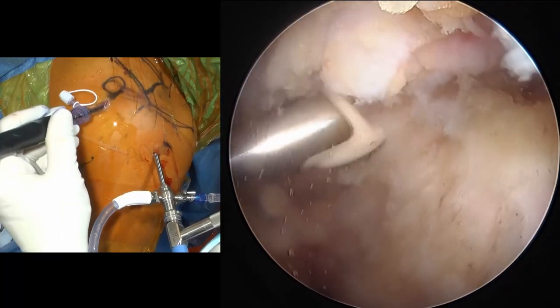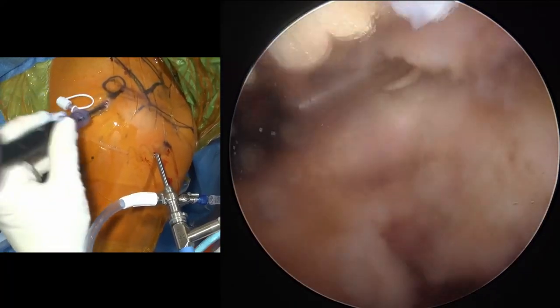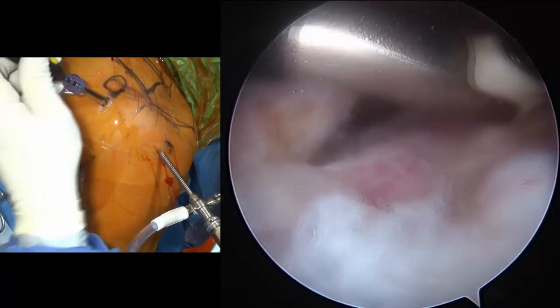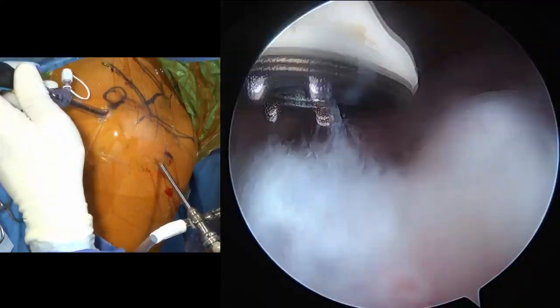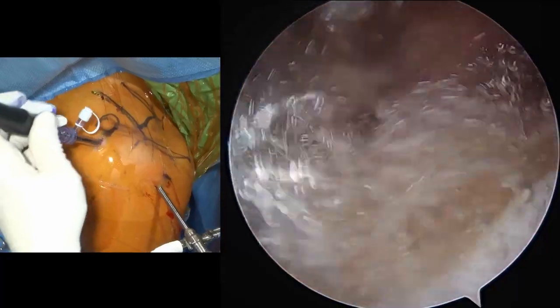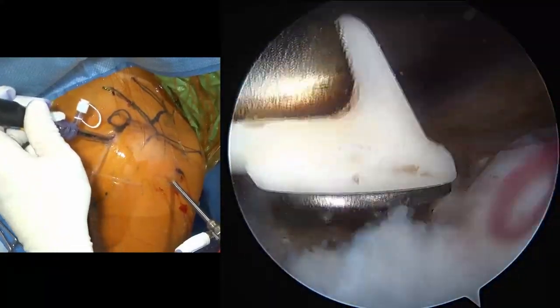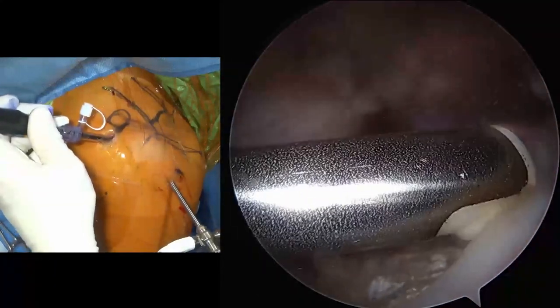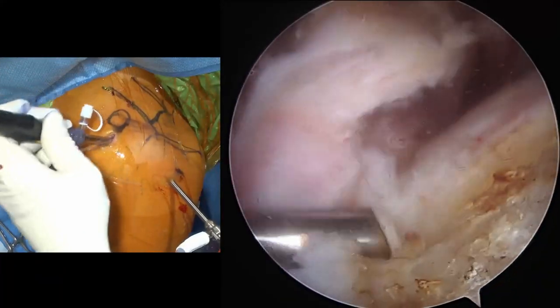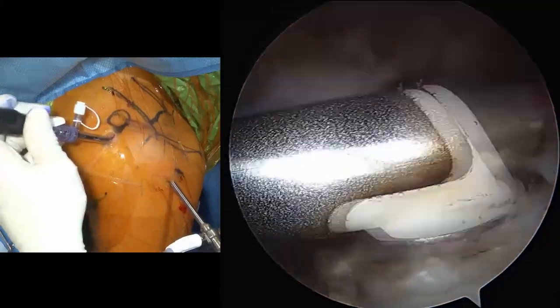The arm's going to start jumping again. Like that. All right, so let's see if we can get over here and get this prepared. Biceps is right there, okay. Open up speed bridge. So we're still going to go for a double row repair here. We might have to diagonal it a little bit to fit the tear pattern. But this is the footprint of the leading edge of the supraspinatus. And so this is what we're going to have to get it back to. Let's have the burr when you get a chance.